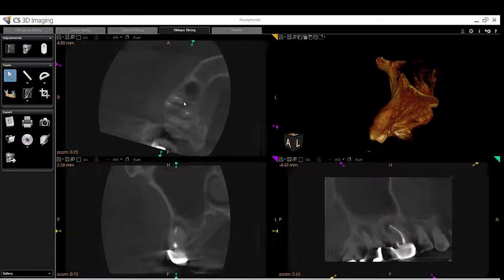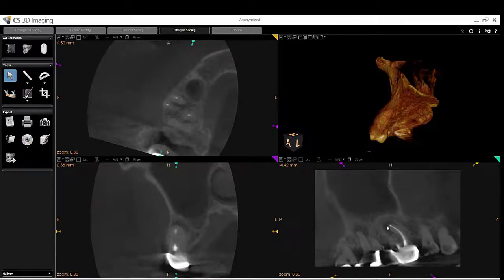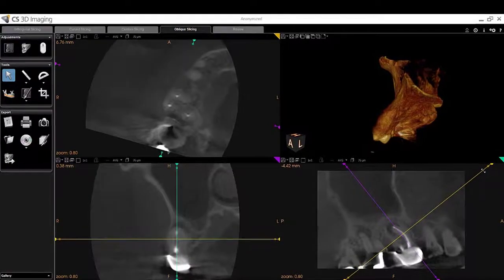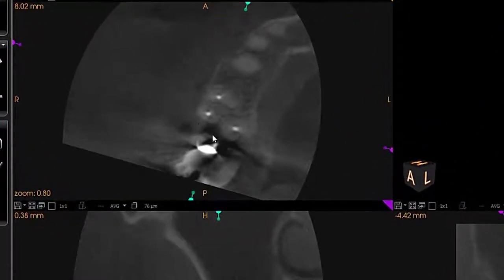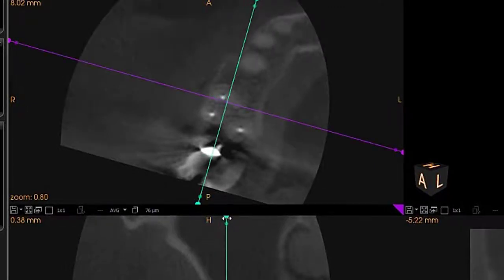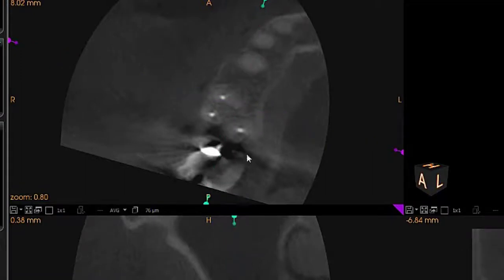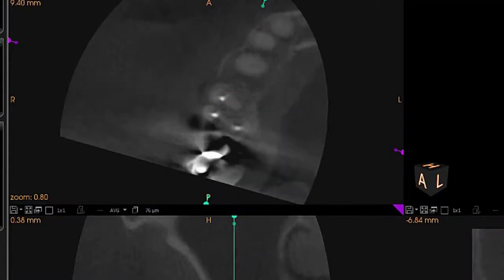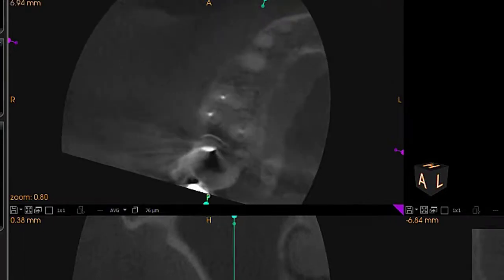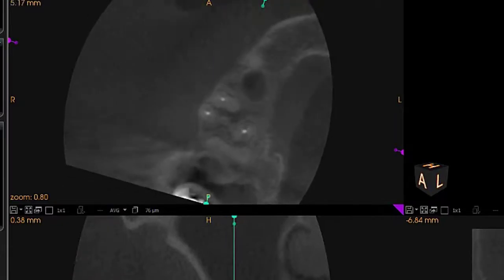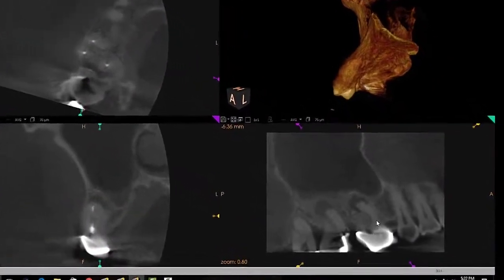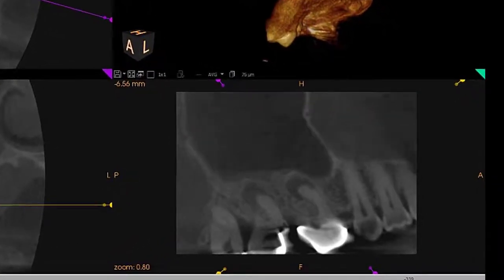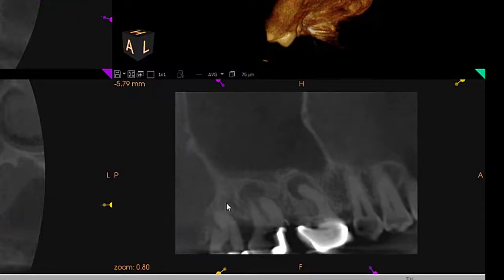My first inclination is to look at the mesial buccal root of tooth number three due to the apical periodontitis and see if there's any evidence of an MB2 canal. Immediately it catches my eye that the MB1 is offset within the root toward the buccal, which is typically a good indicator that an MB2 canal is present. Although I don't see anything blatantly obvious as I go coronal and then apically through the root, I do believe it will be there — there's a hint of something in this area as I go buccal-palatal. We can also see that apical periodontitis is readily visible on tooth number two.